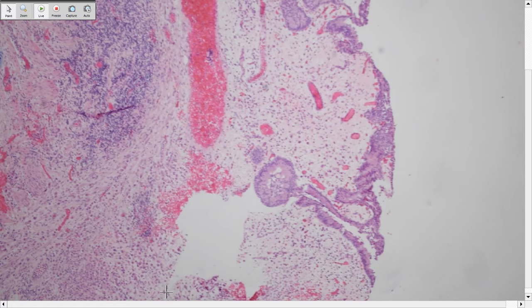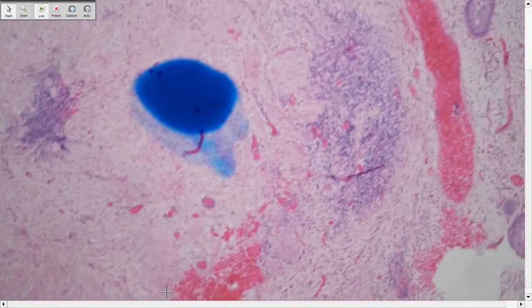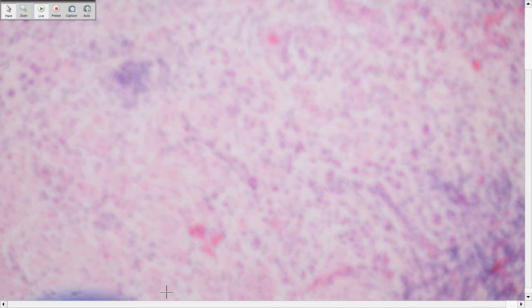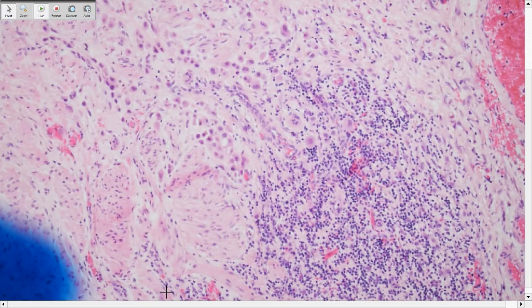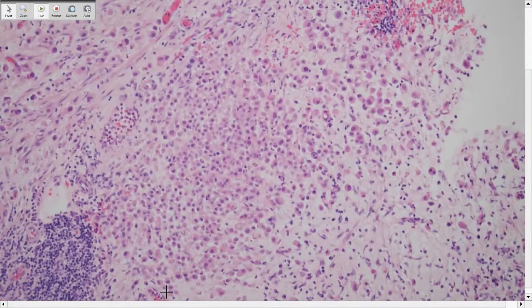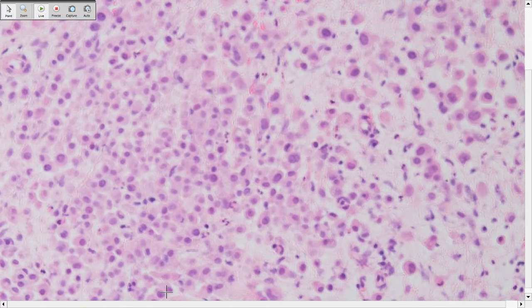This is a 76-year-old male with hematuria, and they did a bladder biopsy. This will be a challenging case if you didn't pay attention. Is it a female? Male. I think Dr. C showed a female patient last time. If I move around, you can see more. You see this is single cell. Is this a met? It could be mets.